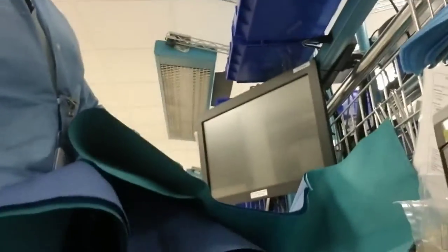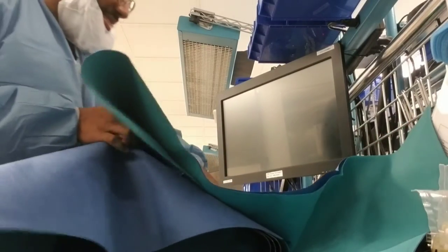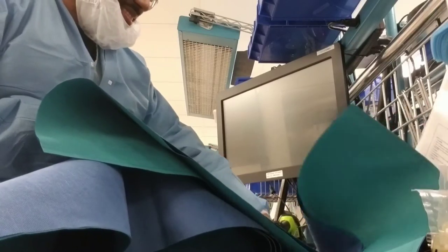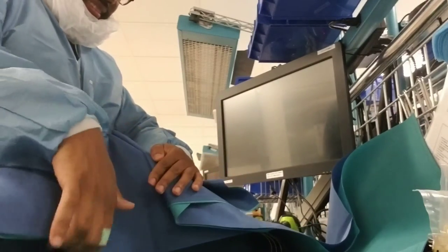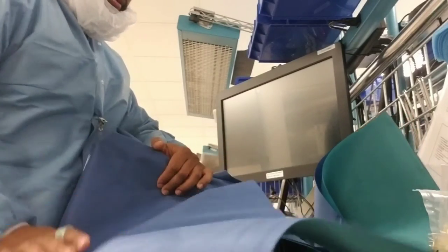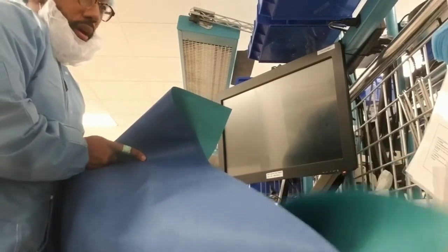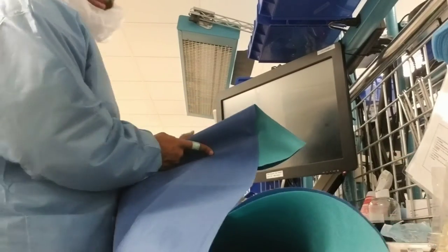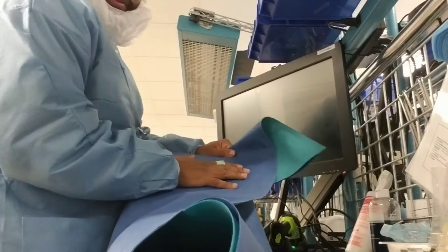Now, you would wrap it. I'm sorry about the camera angle again. So like I said, you will place it in the middle, right? The triangle, but then you will lay it flat down, right? So you would do the normal techniques as far as grabbing one side, flapping it over as you see me doing, and then flapping it to the other side, crisscrossing them to each other, right? That's what you would do in this case.